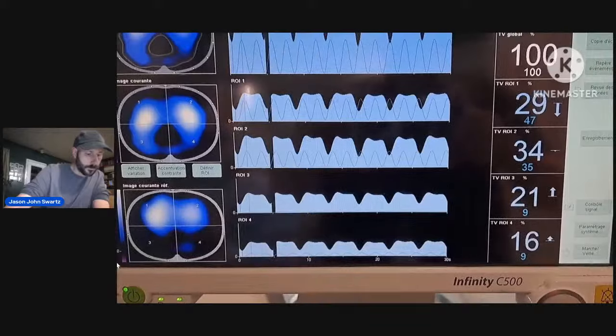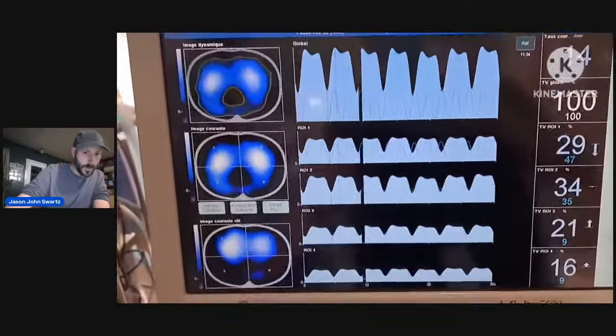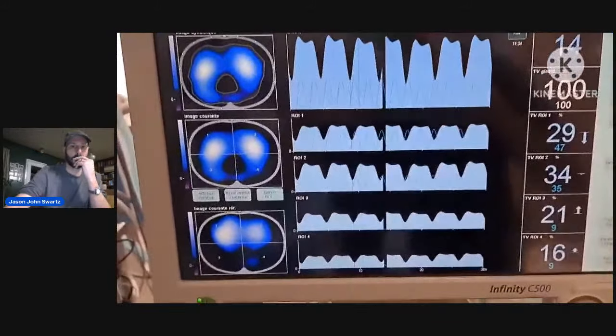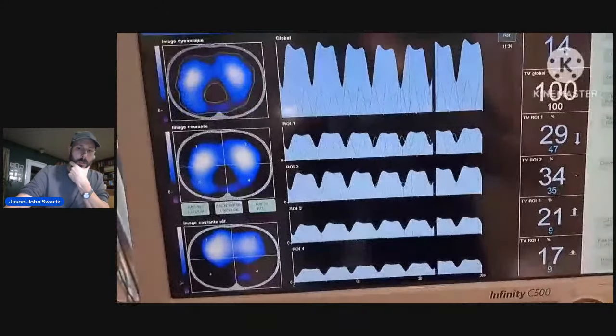That's pretty impressive. Look at that. You see it? Where it started within an hour or two, it was 100, now 75%. And the chest is only moving 14, which is good.